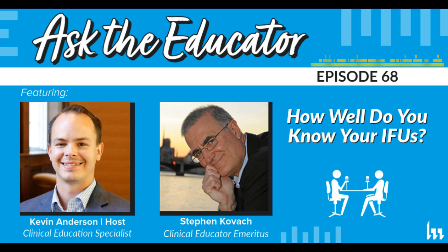And to your point, sometimes it's having those resources, whether it's lighting, magnification, or a borescope or something like that. But sometimes it's just using the tools that are there. So you go through the whole process of getting approval for a borescope or several of them or some other expensive piece of inspection equipment. And you go and you just observe like a fly on the wall, and you see that people are shying away or not using the equipment that you invested in.